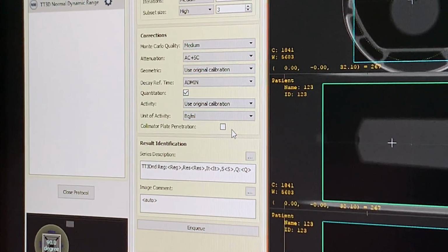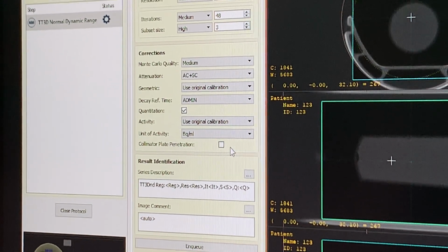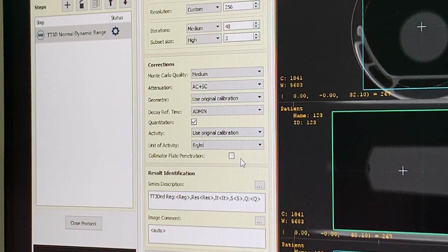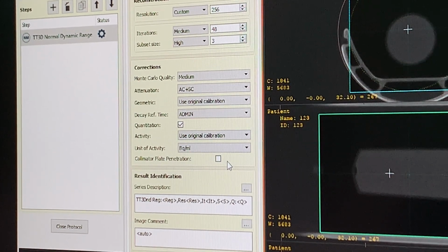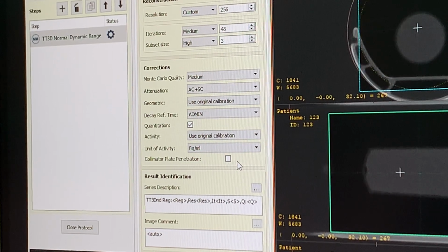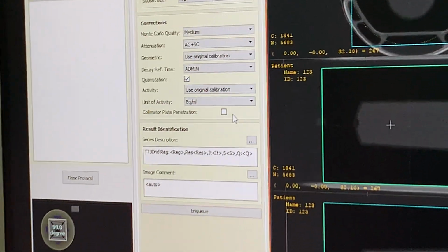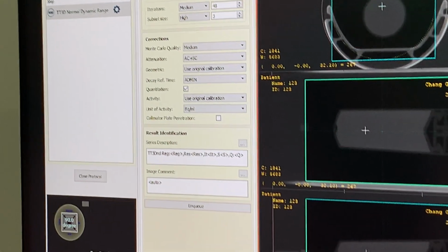High energy photons will directly penetrate the detector, so you would not detect them, but if you turn this on, it can detect them. What is the energy for the high energy? I think it's higher than 300. 300. So like iodine-131, you have to use this.